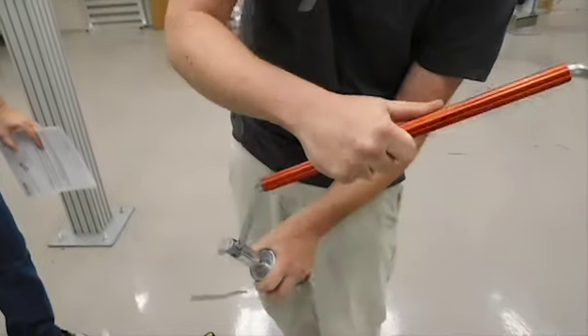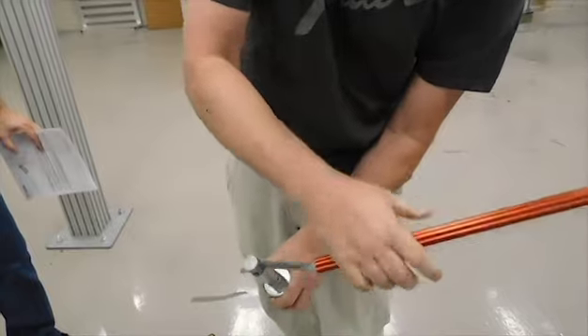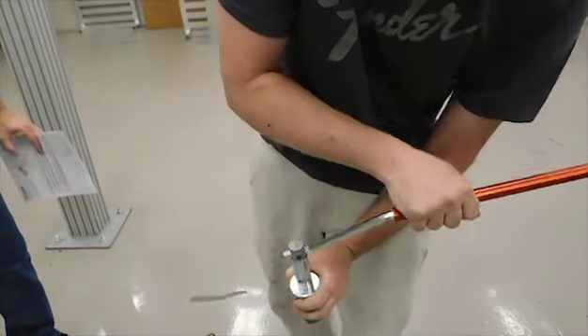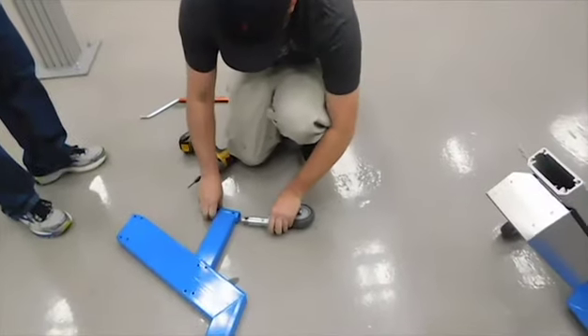And then pull it back. You just want to make sure that when you go to brake it, it goes towards the lifter itself. So that's really important because you don't want to have them vice versa.